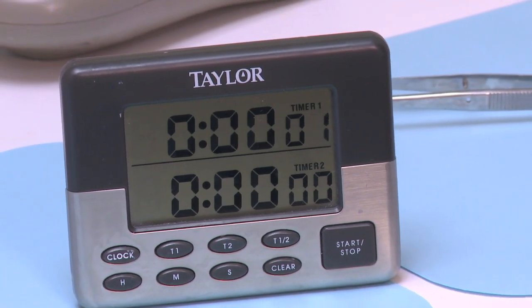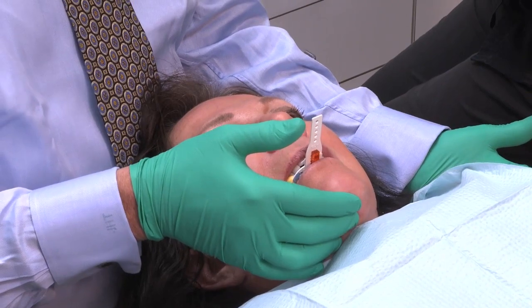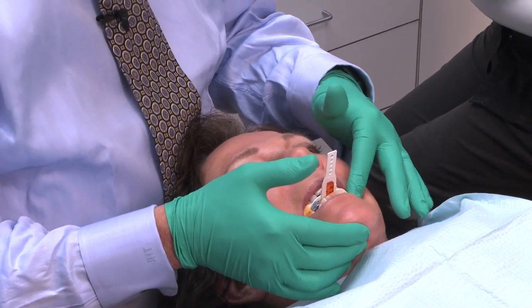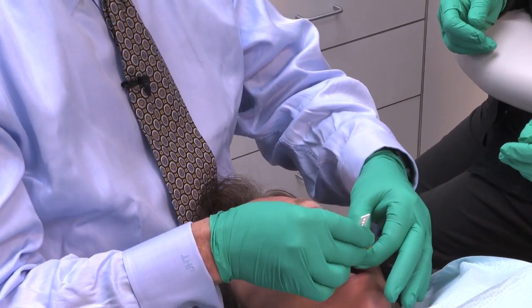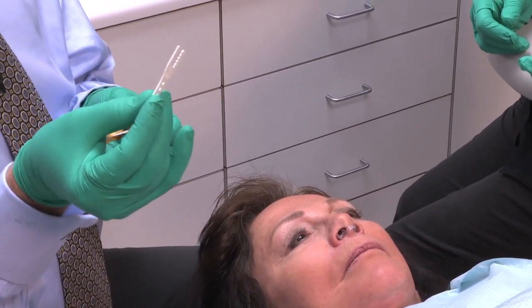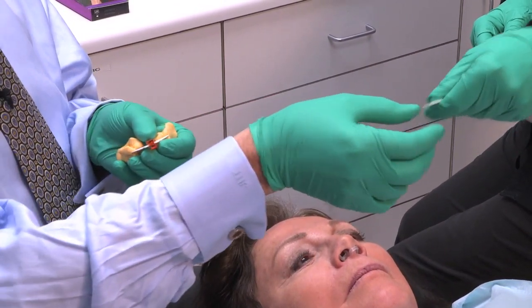Did you start the timer? So our timer has gone off. We want to verify that the putty is set, and it is. And Kim, go ahead and open. You're going to remove the assembly. The handle comes off, and that stays behind and is cold sterilized.